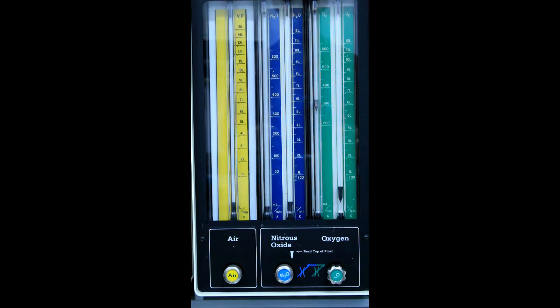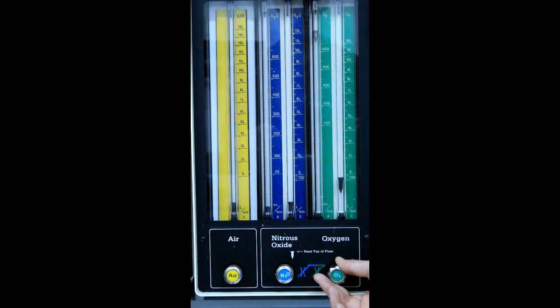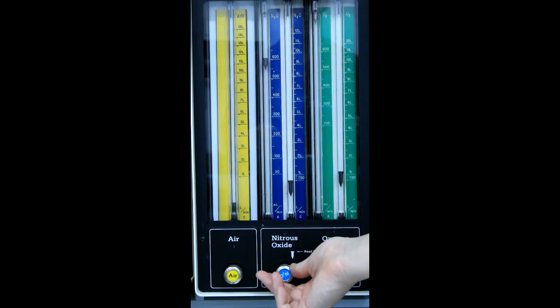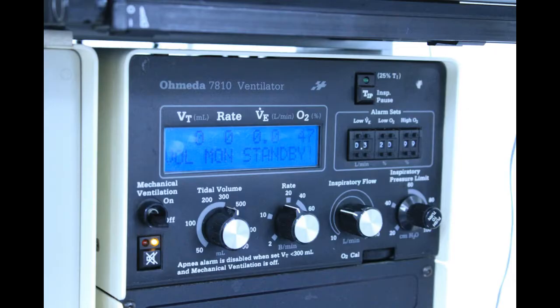The amount of each gas that is introduced to the circuit can be adjusted and controlled by turning the dials on the flow meter. The interface allows the anesthesiologist to monitor the percent of oxygen in the gas mixture that is being delivered to the patient.